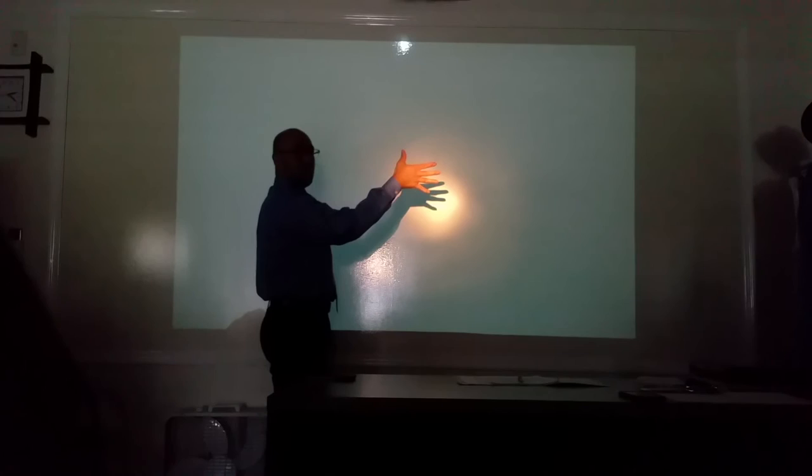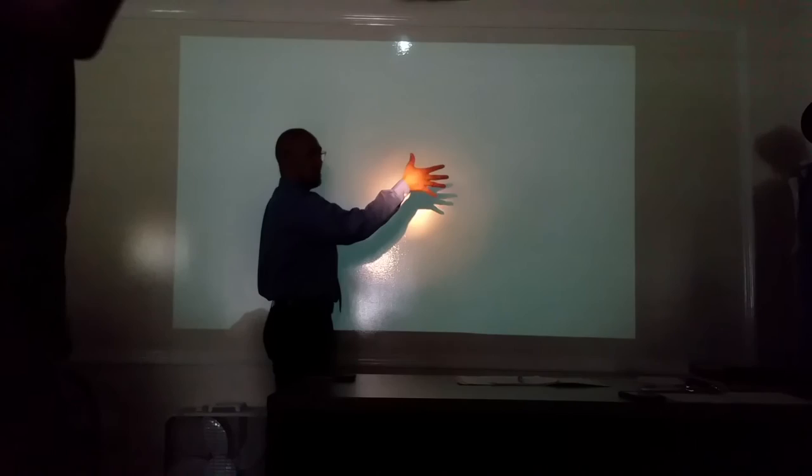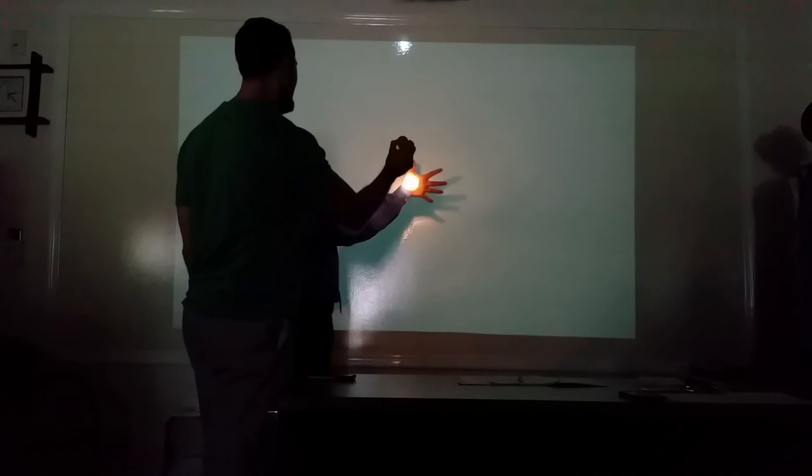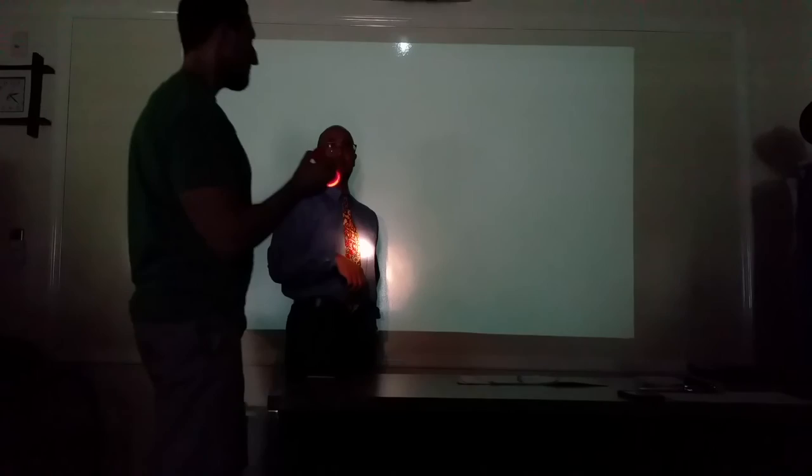Bring it closer. What does magnification do to detail? Look at the edges of my hand. It decreases detail. So now my hand is getting bigger, right? Everybody agree? And look at the detail of the edges of my hand. It's blurry. So magnification, good or bad? It's bad. Anytime you have magnification, you lose detail. So I can decrease magnification by, number one, bringing the tube further away, increasing your SID.